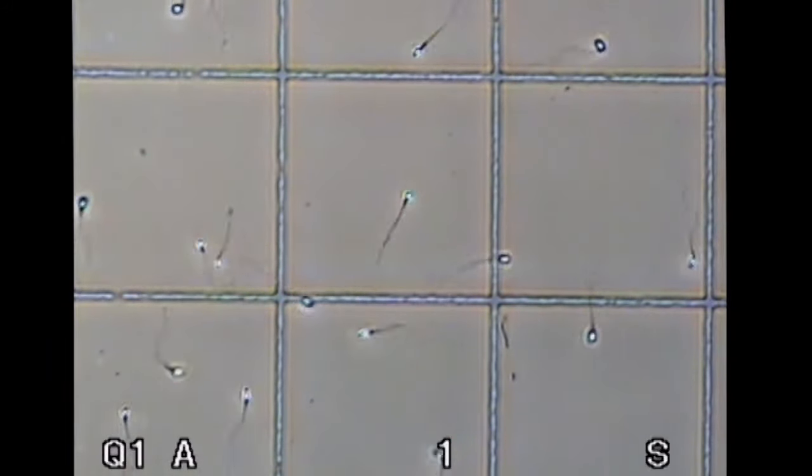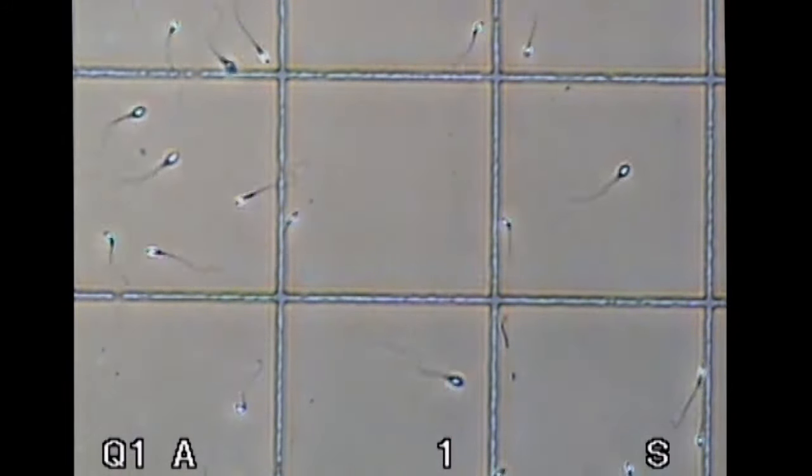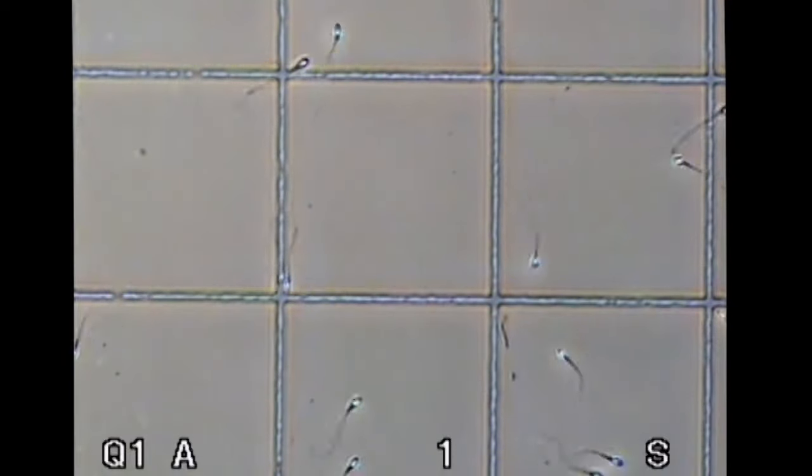Now we can clearly see some details in the sperm cells. This specimen shows a good sperm count and good progressive motility.